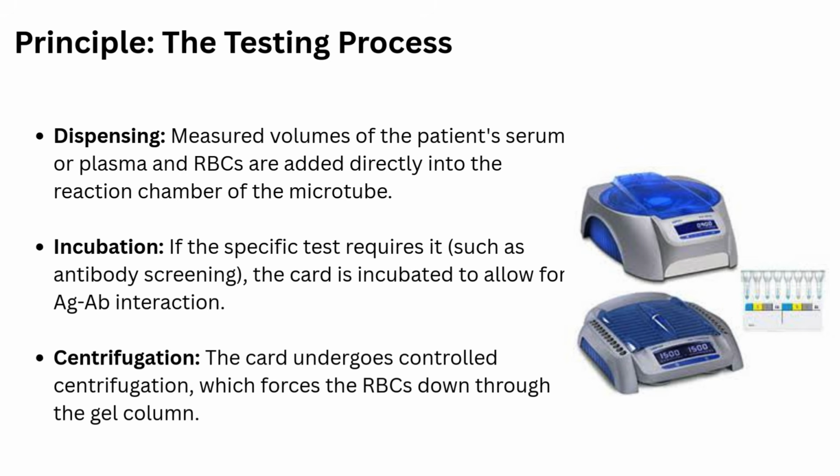And finally, the card undergoes a controlled centrifugation process. This step forces the red cells down the gel column, allowing us to observe and analyze the reaction. Each of these steps, dispensing, incubation, and centrifugation, plays a vital role to ensure the reliability of the test. Now let's move on to the materials that you'll need for the processes.